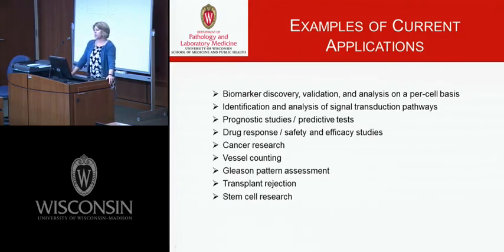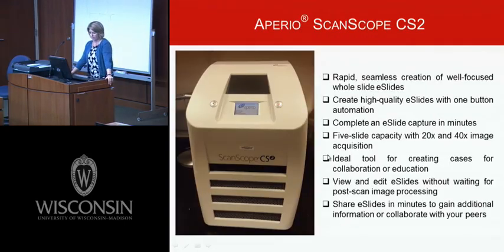So what are some current applications of this multiplex modality? So individuals are using it for biomarker discovery, validation, and analysis, identification of signal transduction pathways, prognostic studies and predictive tests, drug response, very hot area here within our cancer center, cancer research, vessel counting, Gleason pattern assessment, transplant rejection, and stem cell research are just a few areas where this type of technology is being utilized.